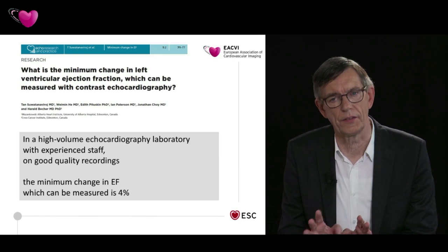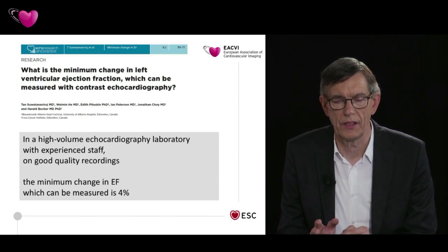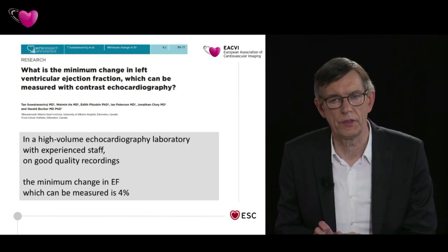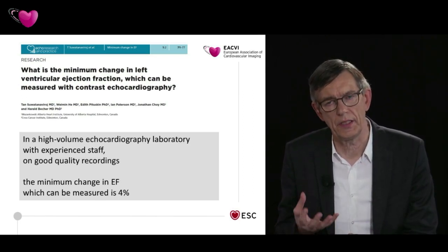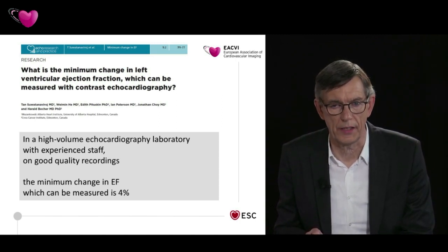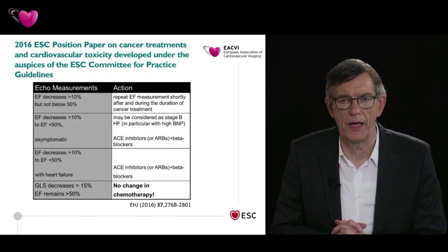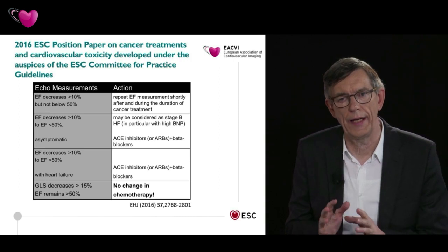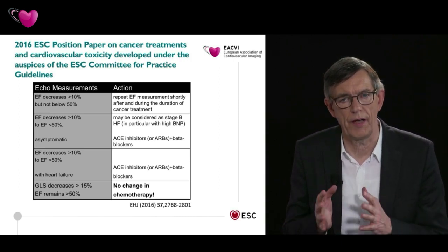Now, this is under the best conditions, and in clinical practice it's probably a few percent higher if we also include some patients with suboptimal images, but it clearly shows where we stand with our accuracy in contrast echocardiography. And just my last slide, also from the ESC position paper, to highlight the importance of accurate measurements of the ejection fraction.